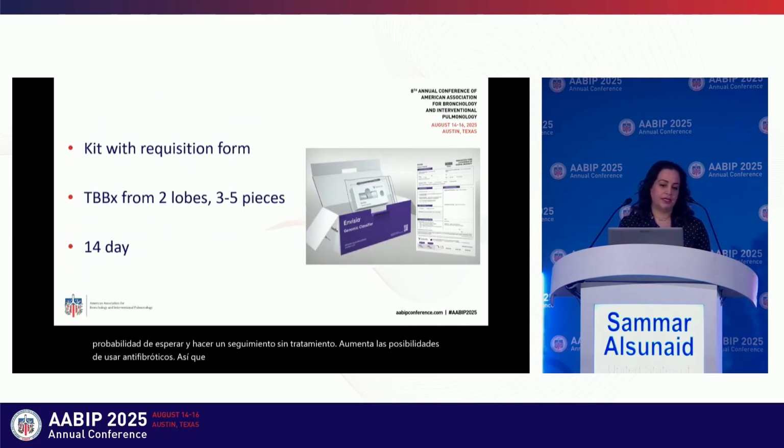It's a kit, you get it, you do your transbronchial biopsies from 2 lobes, 3 to 5 pieces, you send it out, and you get an answer within 14 days.